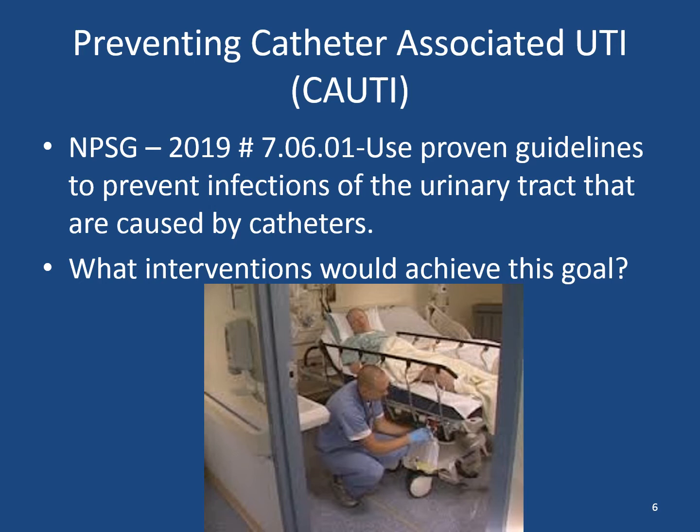We want to maintain the system, make sure that we're using good hand hygiene when we're handling it, and encourage our clients to utilize hand hygiene practices as well. Maintain unobstructed flow, because if it becomes obstructed, the urine can actually back up into the bladder, increasing our risk for infection. Maintain a closed system whenever possible. So we don't want to detach the drainage bag and reattach it multiple times. Every time we're doing that, we're increasing the risk for infection.